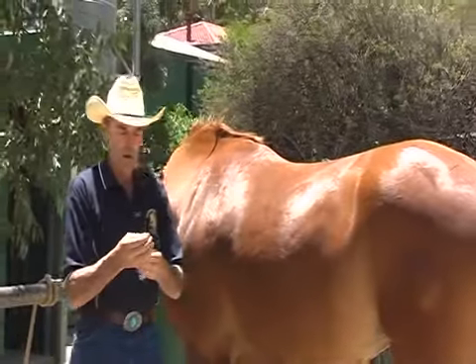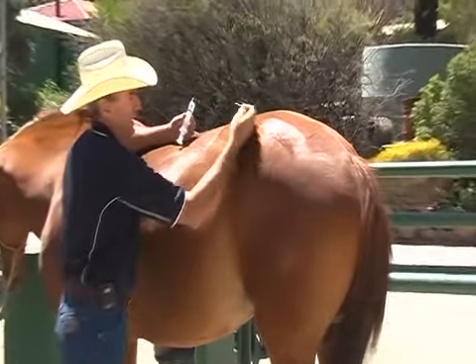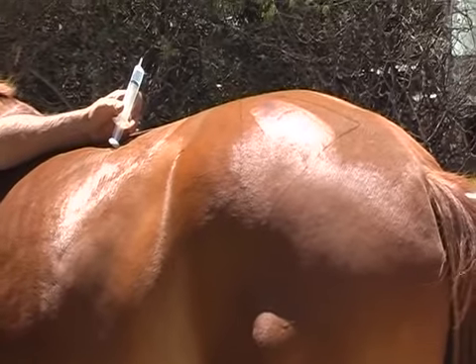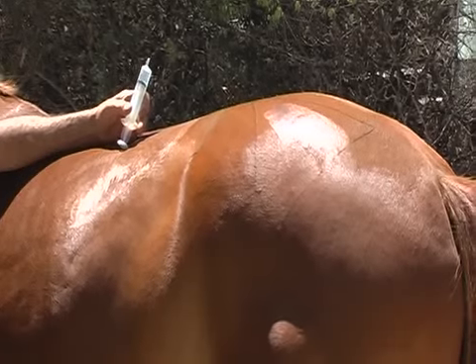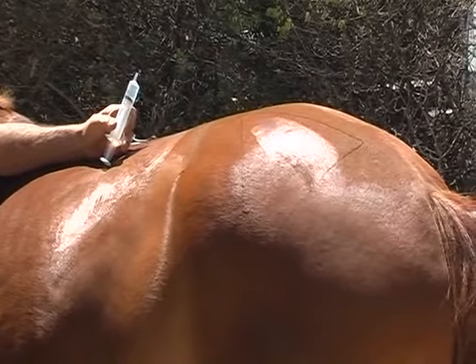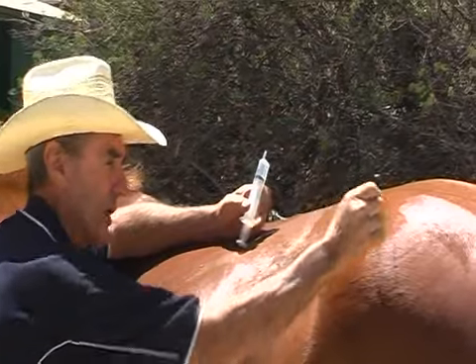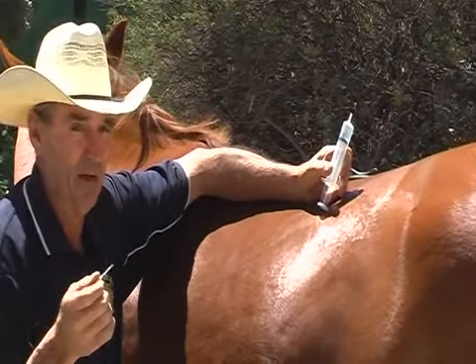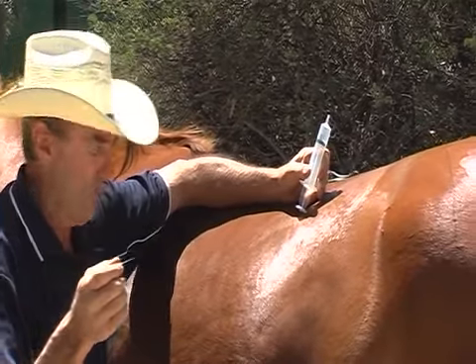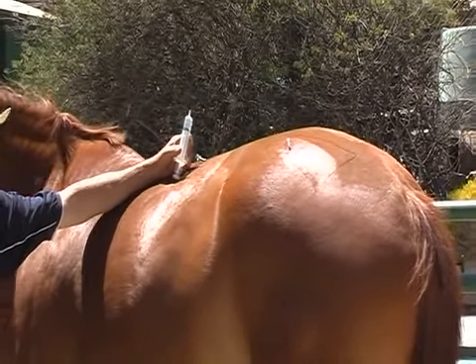Now, take your needle off there. You can either hit once, twice with the back of the hand if you've got a very touchy horse and you want to take it by surprise, or in the case of this one here, I'll just put it in. Now, it hurts horses far more and more chance of you getting kicked if you try and just slowly push and be soft about it to horses. So just be aggressive and just throw the needle in. Far better for the horse and less pain. So there it is, as simple as that.